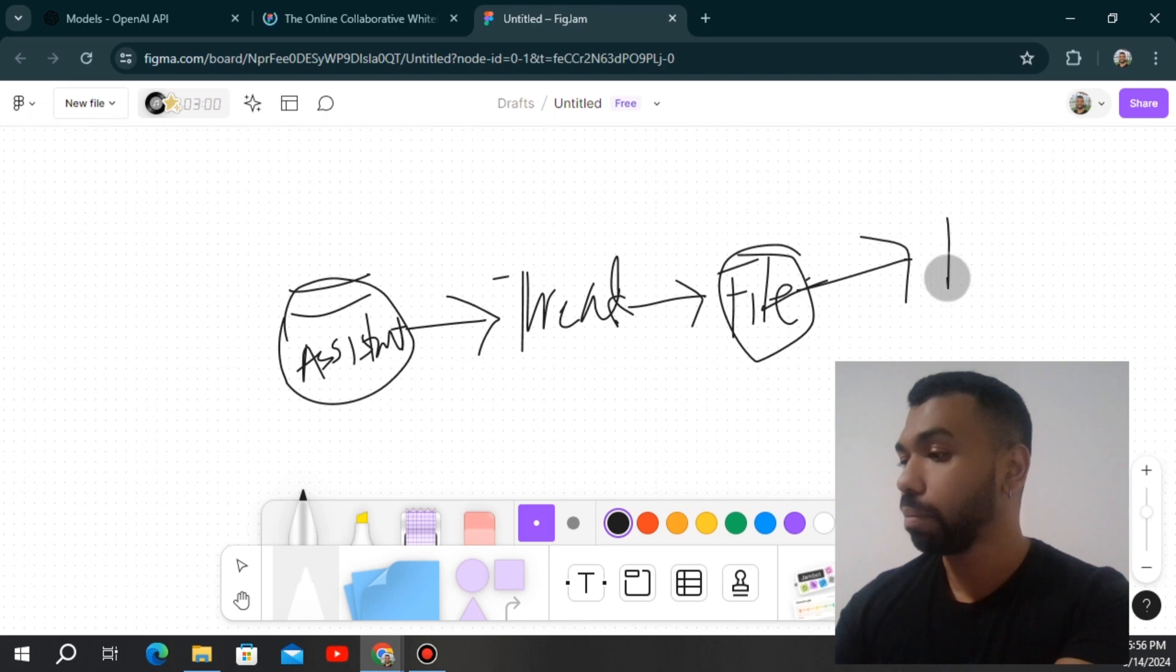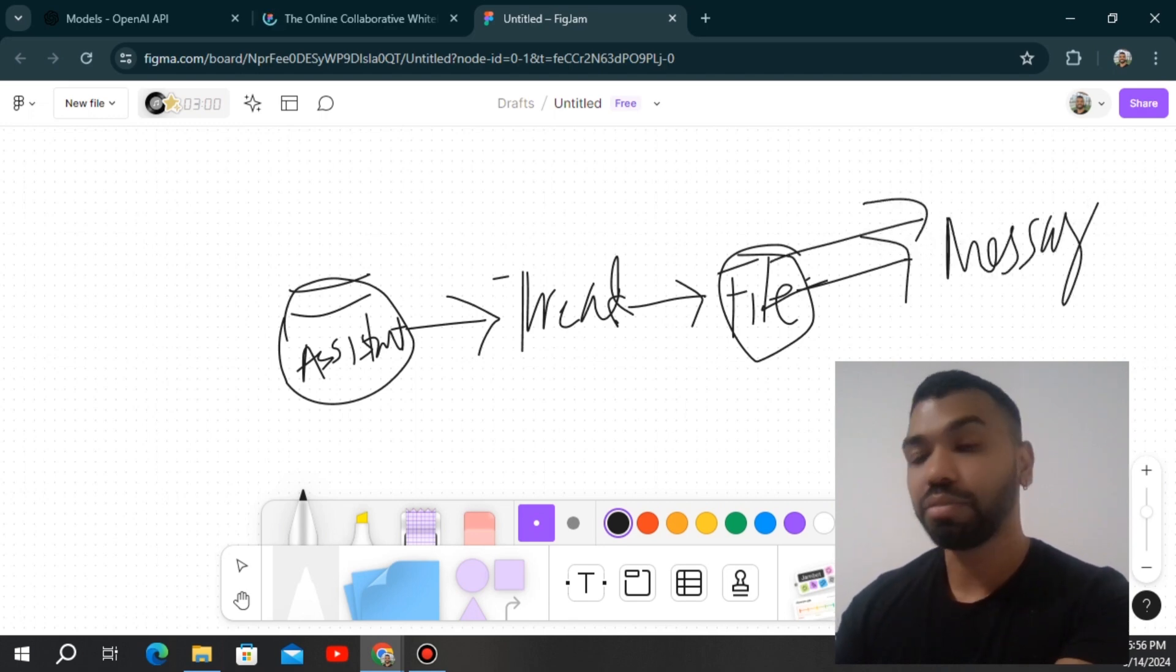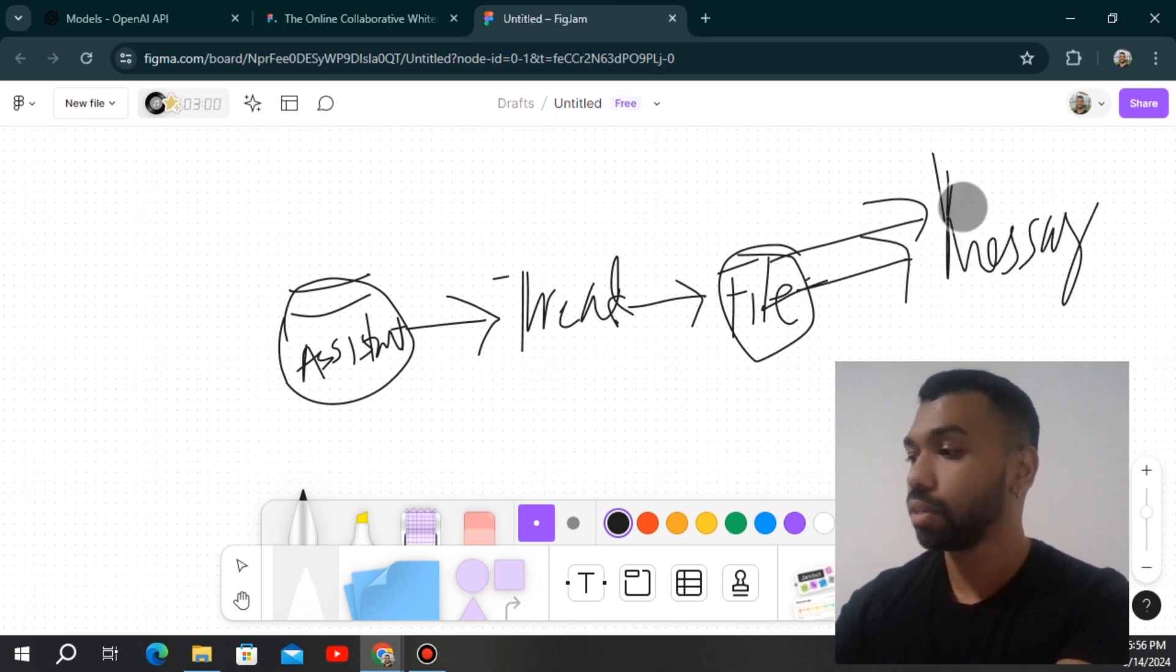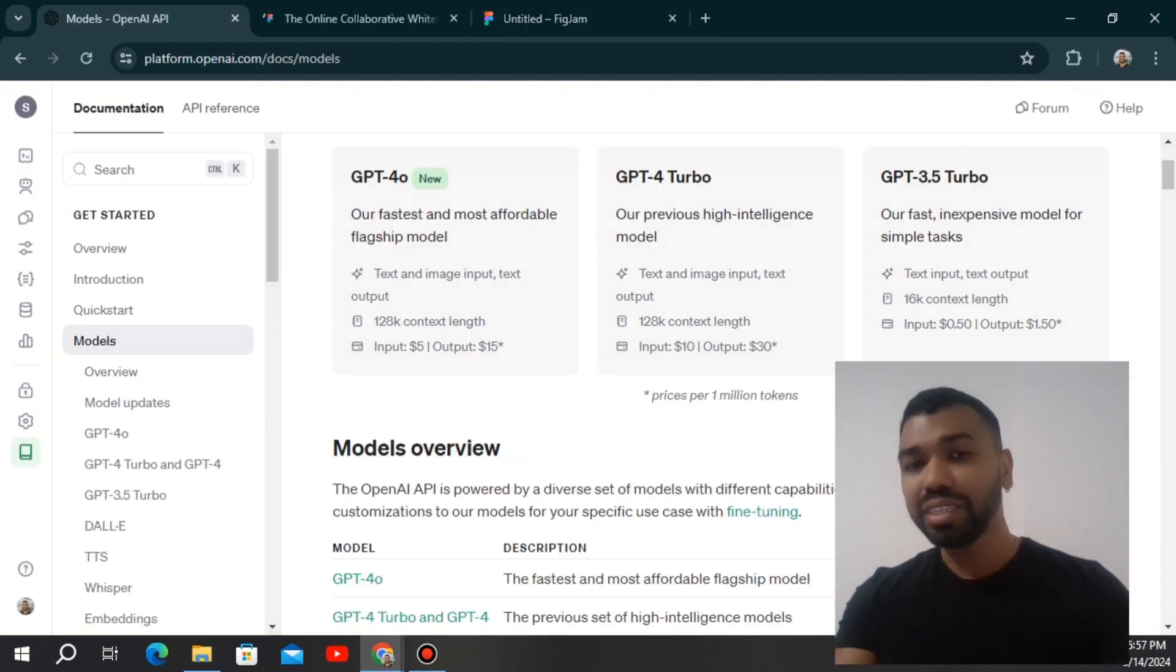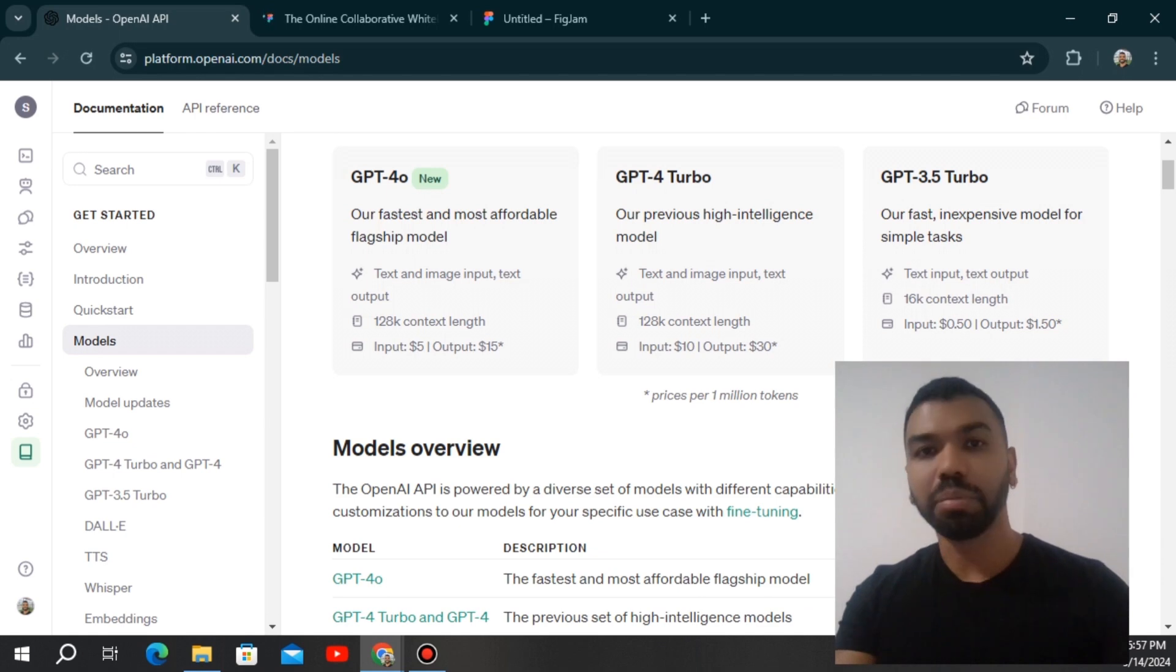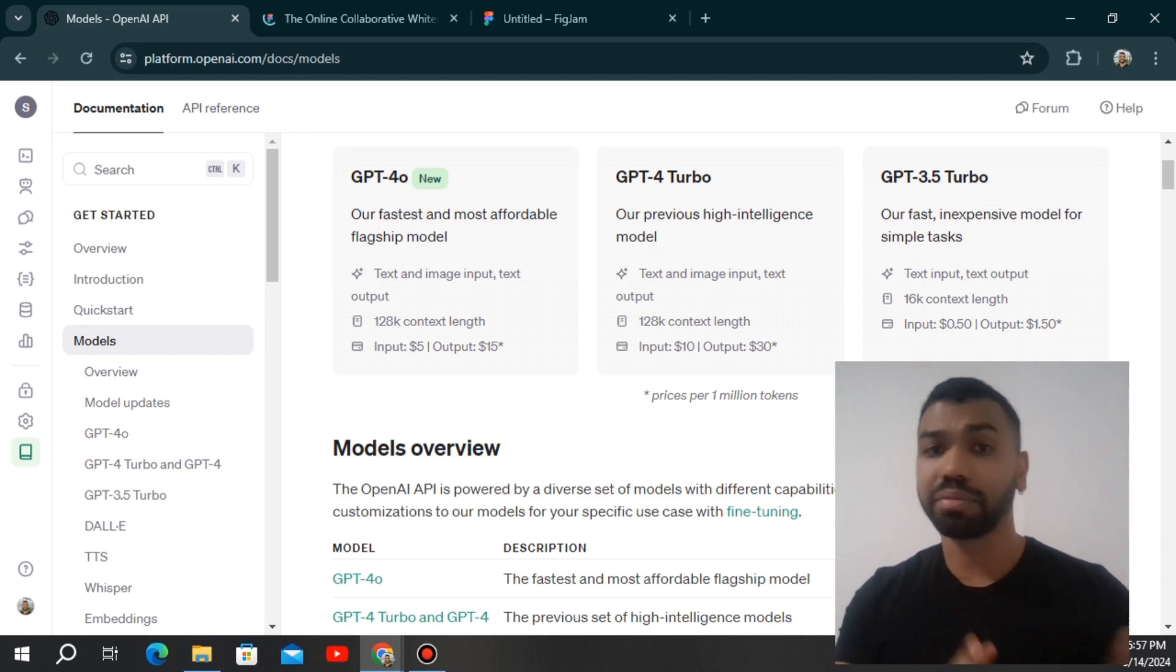And then when you're sending the message, you basically insert this file as a image along with your text. And then you're going to get the assistance response. It's really simple, but it's really important how you implement this into practice, because there's a lot of avenues you can take this.